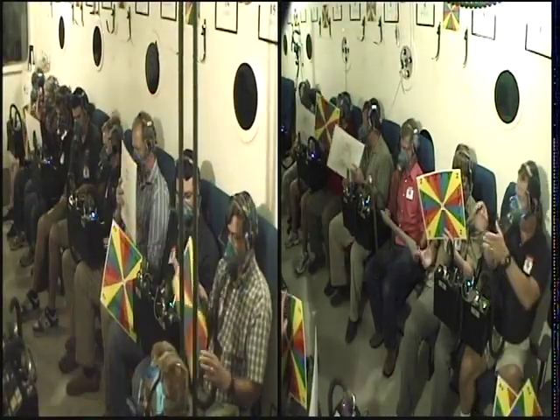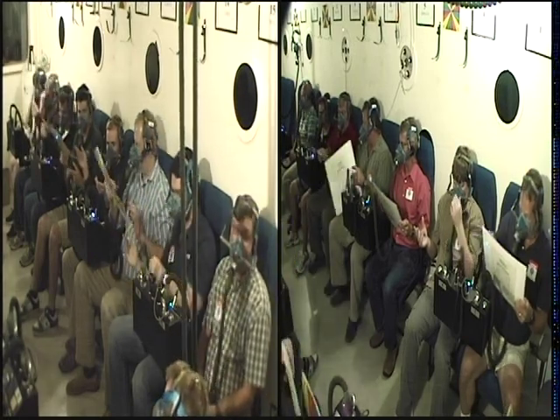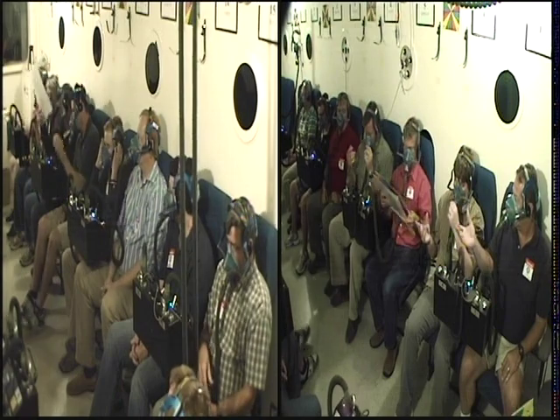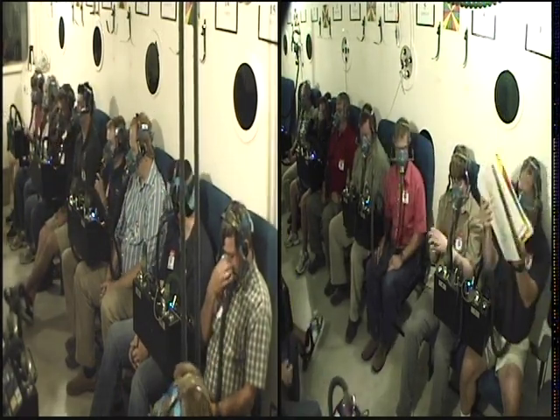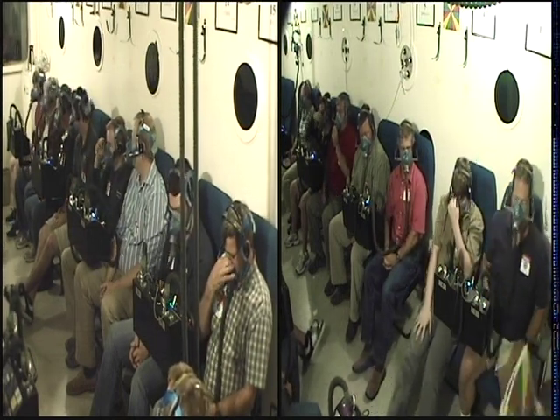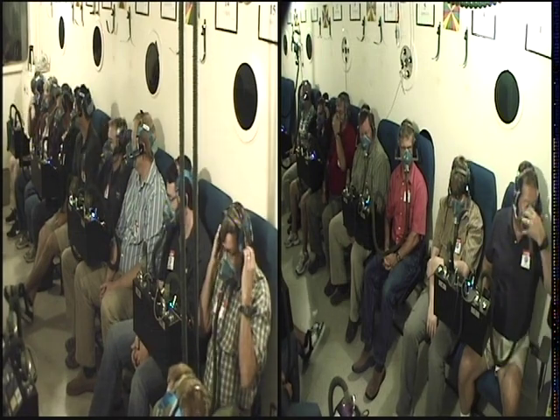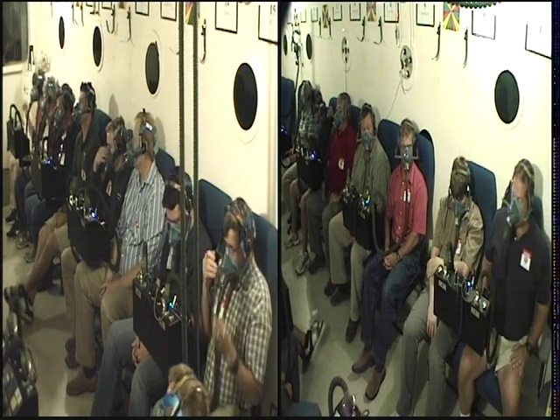And we are going to go ahead and start our descent, with JR's permission, towards ground level. Now that we are starting our descent, that is your cue to stay ahead of your ears. Make sure that you equalize all the way down so we don't have any issues with ear blocks, sinus blocks. As long as you do that, I will go ahead and discuss what we experienced during our demonstrations, but make sure your main objective is to remain equalized.